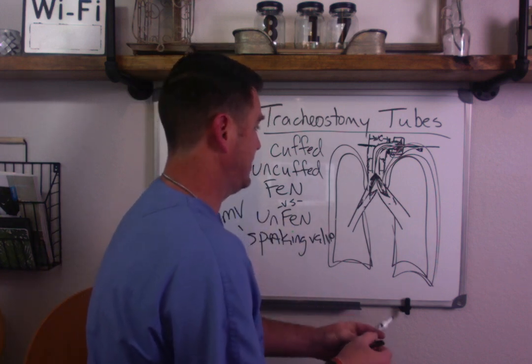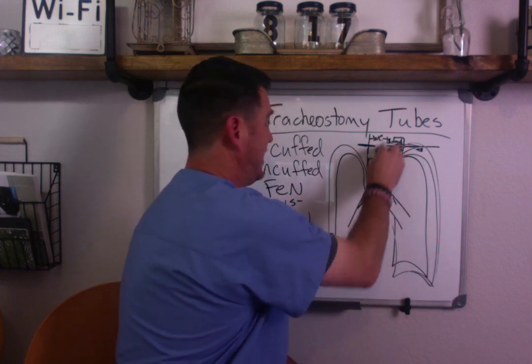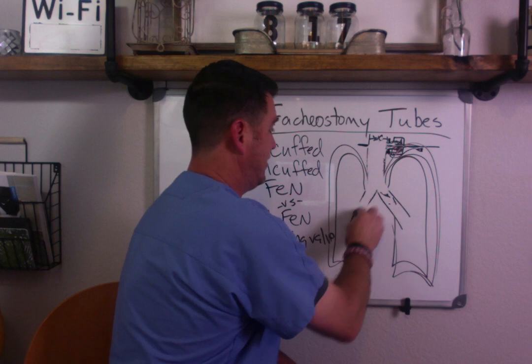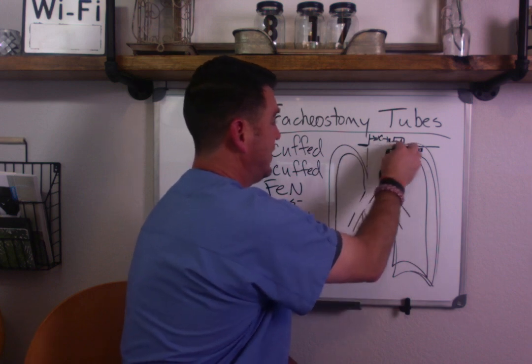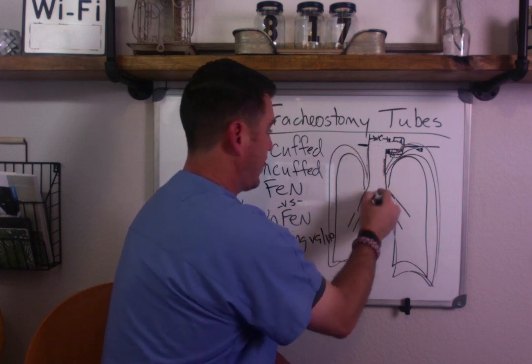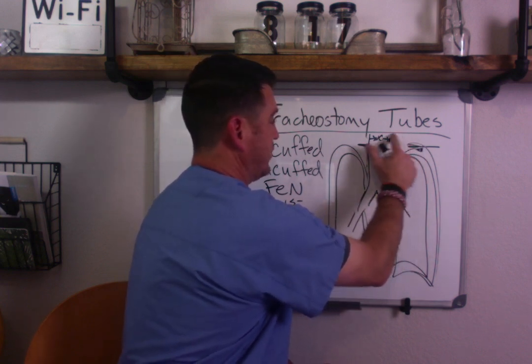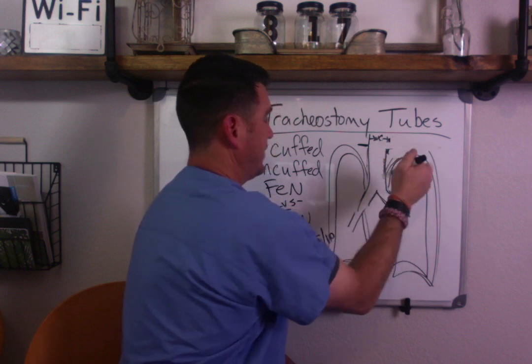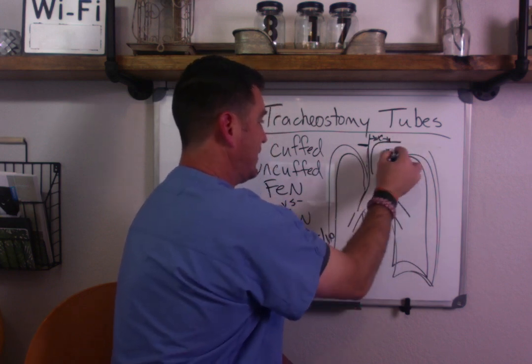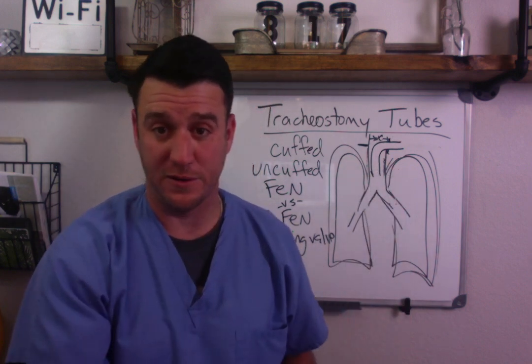I'm going to try to clean this up again because it's a mess up here. But this is the way we teach, guys. This is the way we show it. We say, let's go, let's make a mess of it, and we'll clean it up, okay? So we've got our airway here. There's another trach, and I'm not talking about the Passy-Muir valve anymore, so I'm going to take this down, okay? There's another trach that comes in like this, and it has a foam cuff.